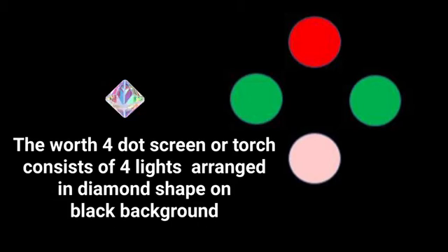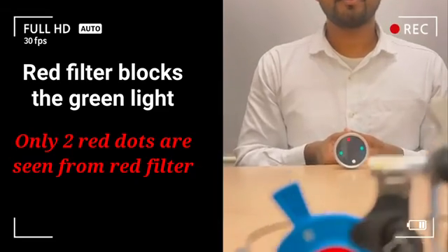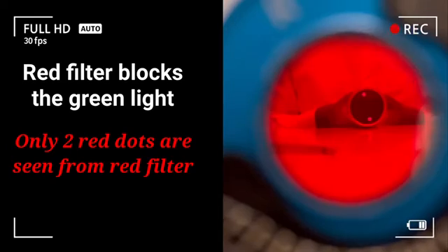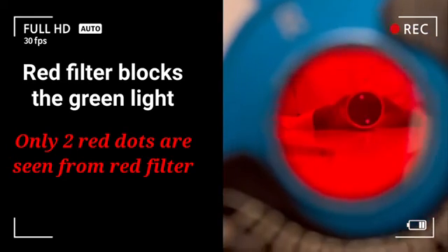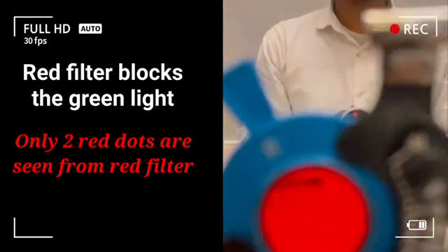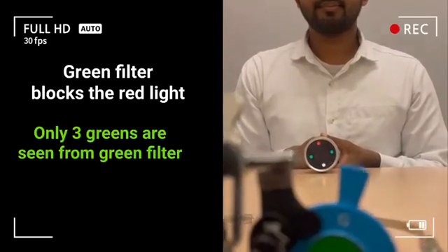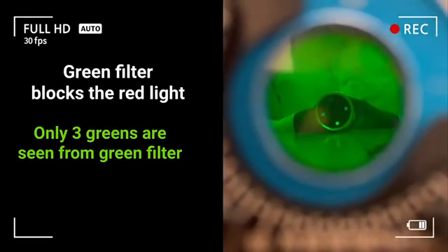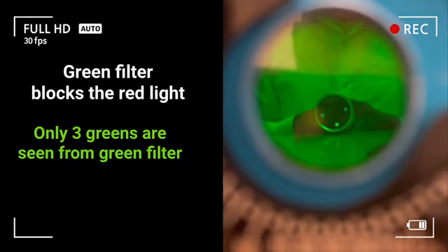The Worth 4-Dot screen or torch contains four lights arranged in a diamond shape on a black background: one red, two green, and one white colored light. When the patient sees these four dots through the red filter, it cuts off the green light and only two red dots will be seen. Similarly, when seen through the green filter, it cuts off the red light and three green dots are seen.